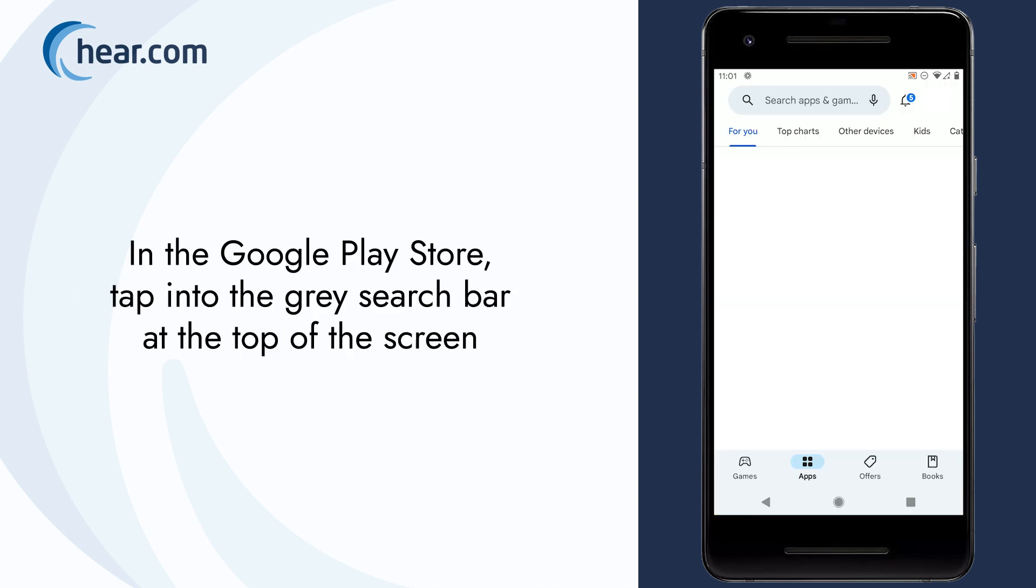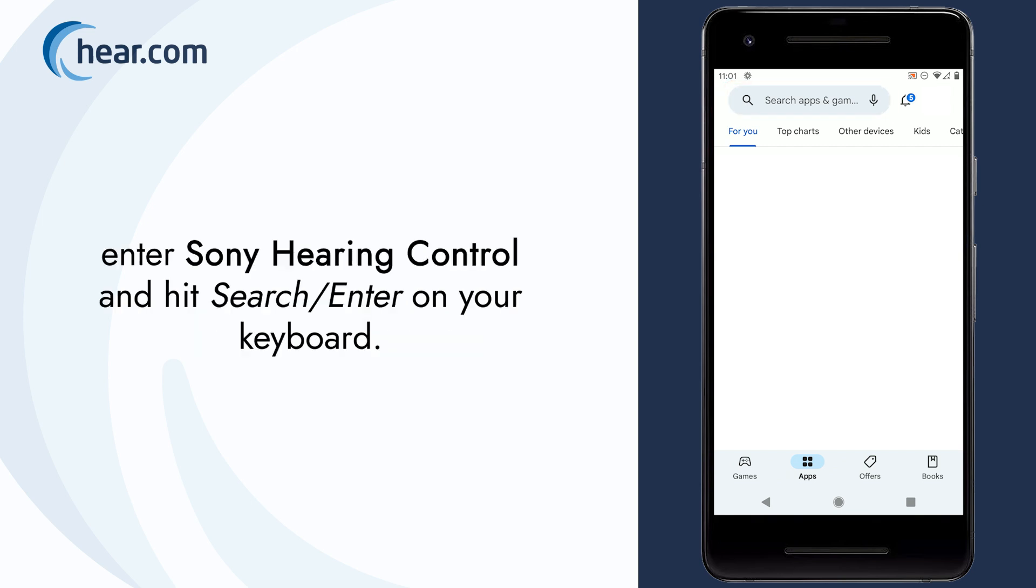In the Google Play Store, tap into the gray search bar at the top of the screen, enter Sony Hearing Control, and hit Search Enter on your keyboard.